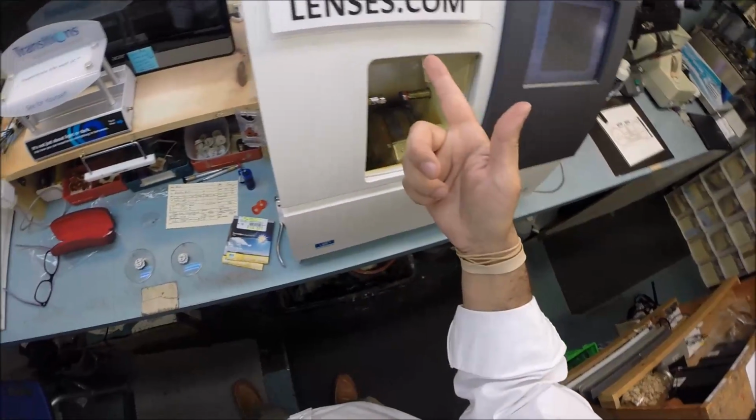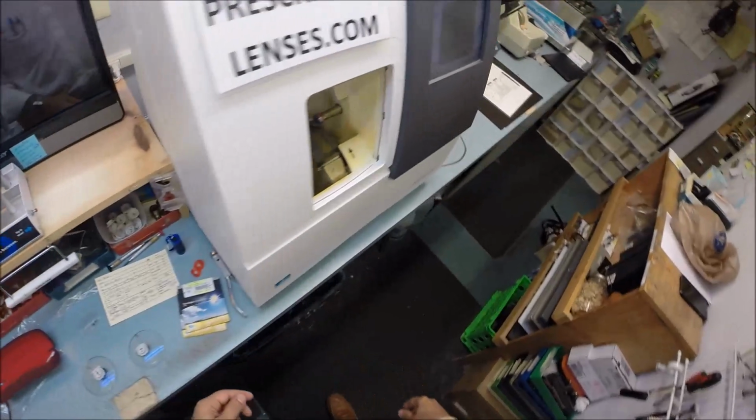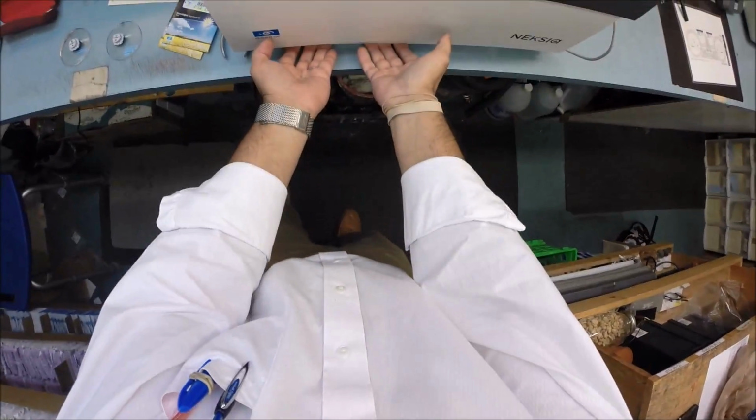Now, this comes into play. This is the edger. This is what costs $40,000. It weighs 200 pounds. You don't believe me? Watch. I can't lift it.